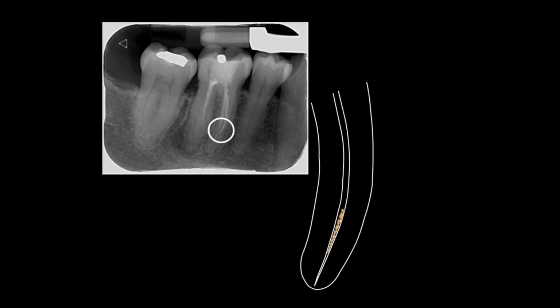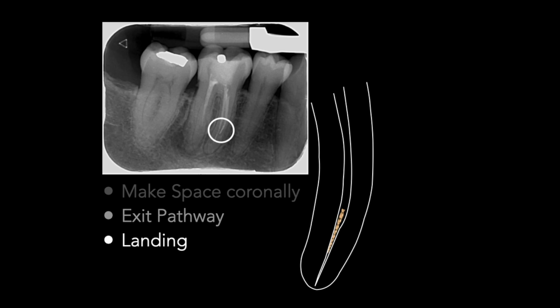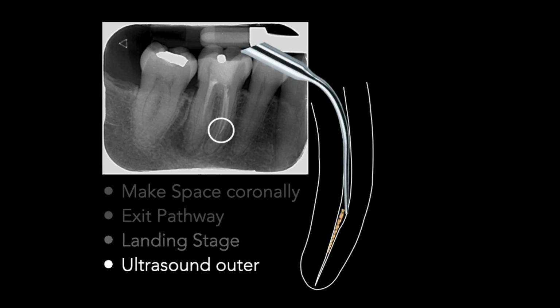Although lodged very deep in the mesial canal, I felt confident that I could remove the larger piece of fractured instrument from the mesiolingual canal. In this case, there's a few things that are very important. You need to make sure you've got space coronally, and that there's an exit pathway for the piece of instrument to be retrieved. First of all, you cut a landing stage around the most coronal part, and then use your ultrasonics on the outer curve to loosen and retrieve the instrument.